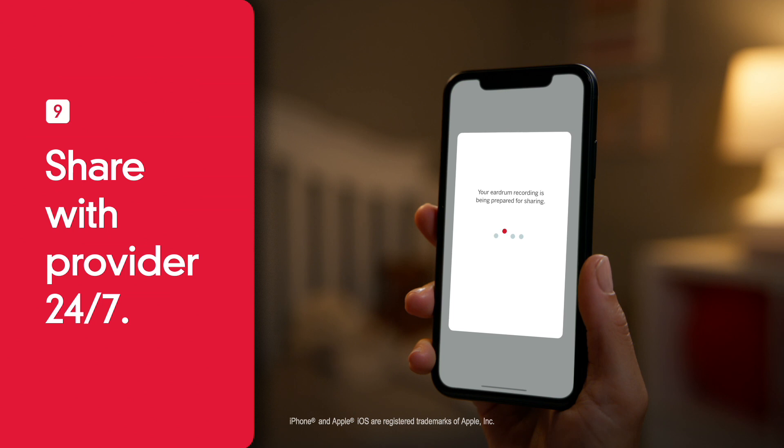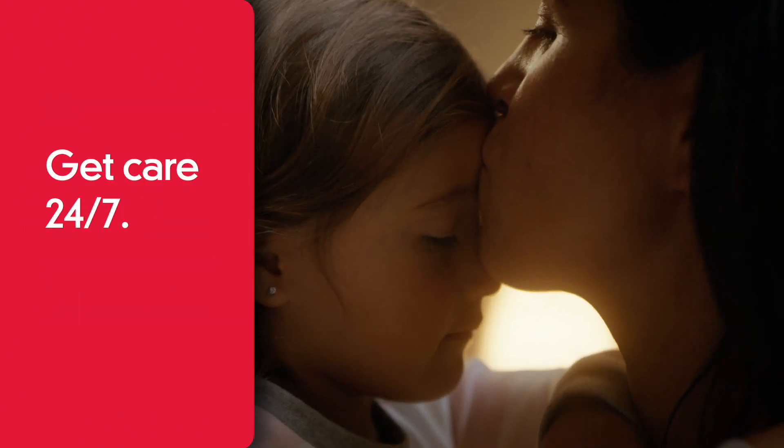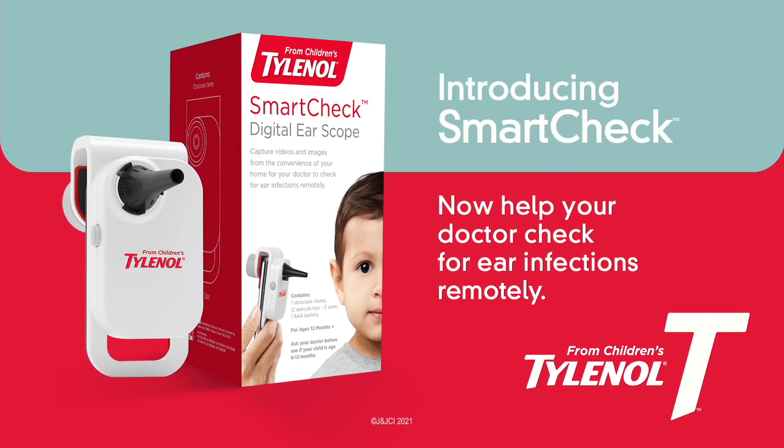Finally, share with your provider anytime. Get care 24-7 with SmartCheck from Children's Tylenol. Now it's easy to help your doctor check for ear infections remotely.